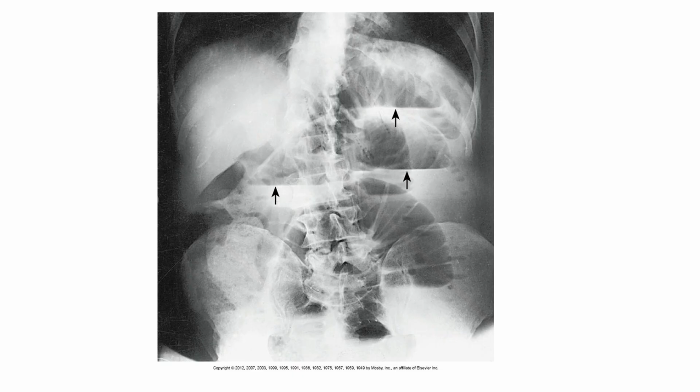Third, the black arrows. You see the horizontal lines there? You see they're at the bottoms of air bubbles? Okay? That is an air fluid boundary. A chemist looking at a beaker or a graduated cylinder would call that a meniscus. It's an air fluid boundary. Air fluid boundaries are going to show up just like they do in visible light. Like if you're in chemistry and you want 100 milliliters, you pour the fluid into the graduated cylinder and you read the meniscus. Okay? You read the air fluid boundary.